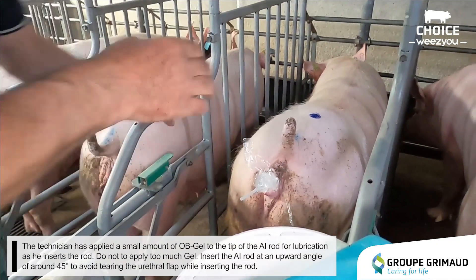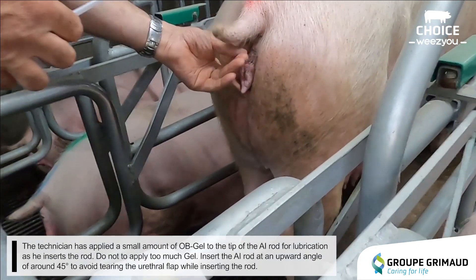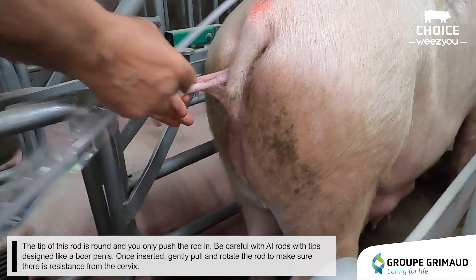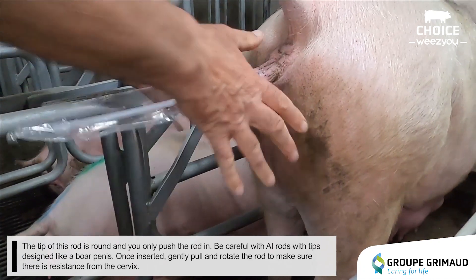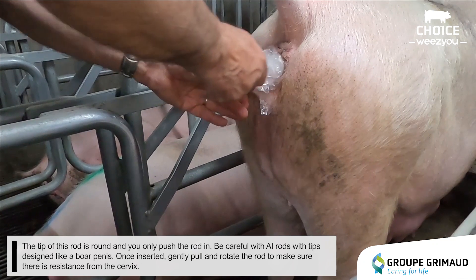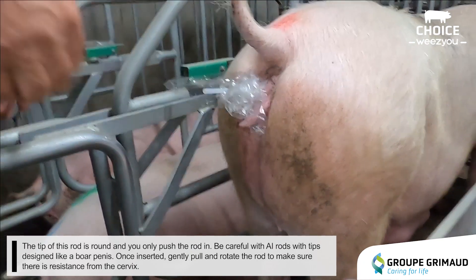Insert the AI rod at an upward angle of around 45 degrees to avoid tearing the urethral flap while inserting the rod. The tip of this rod is round and you only push the rod in. Be careful with AI rods with tips designed like a boar penis. Once inserted, gently pull and rotate the rod to make sure there is resistance from the cervix.